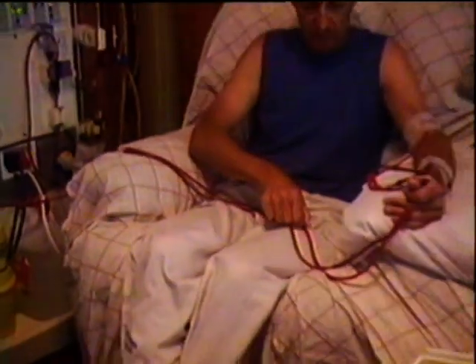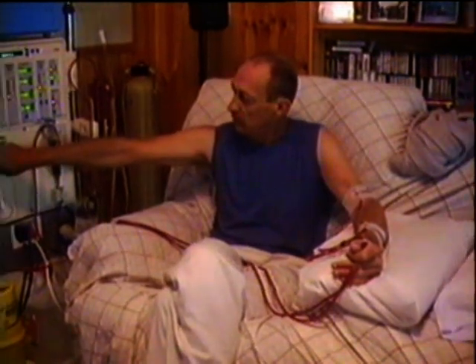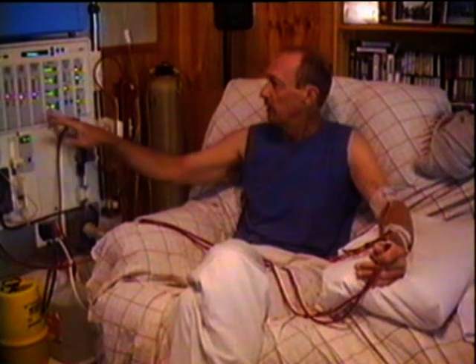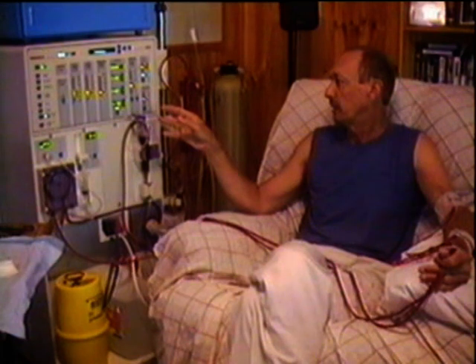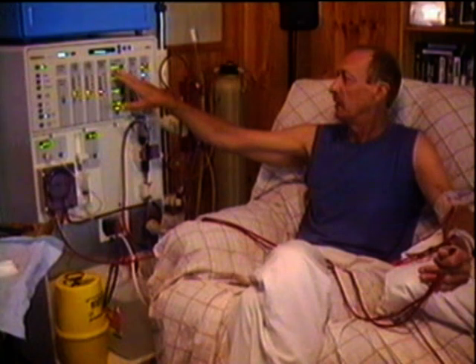Now that's flowing through and here it is going back into my arm. The speed's only 140, so what I have to do is take that up to 300 mils per minute. Now we've got it flying at 300 mils per minute — there's 300 mils of blood coming out of me going through the machine. Now we have to turn the ultrafiltration system on. This, using pressure, will take 2.4 liters of fluid out of that blood. It takes it out at 480 mils per hour, and on the top it tells you how much it's actually taken out as time goes by.